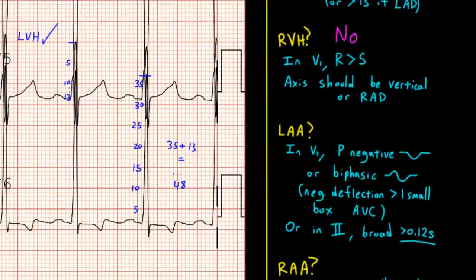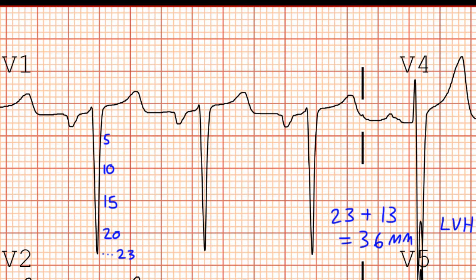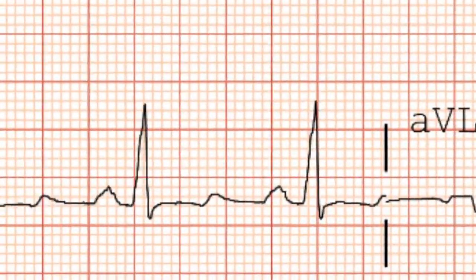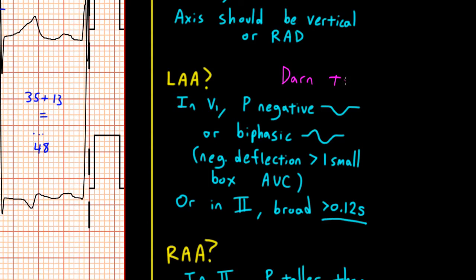Now let's look for signs of left atrial enlargement. For left atrial enlargement, we look in lead V1 for a P-wave that's negative or biphasic, and the negative deflection should be greater than one small box in its area under the curve. Alternatively, we can look in lead 2 for a P-wave that's broader than three small boxes in width. Looking in lead V1, we can see a P-wave that's very negative and slurred — textbook for left atrial abnormality. Looking in lead 2, the P-wave is fairly broad — about three small boxes in width — also consistent with left atrial abnormality. Darn tootin.